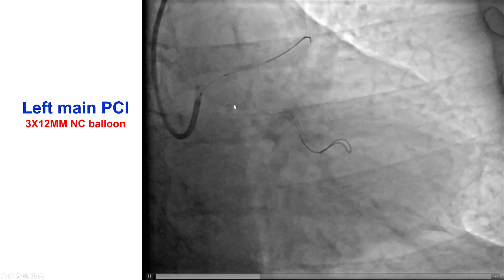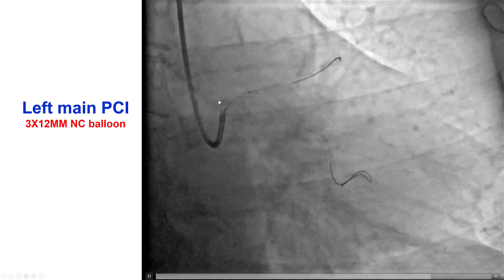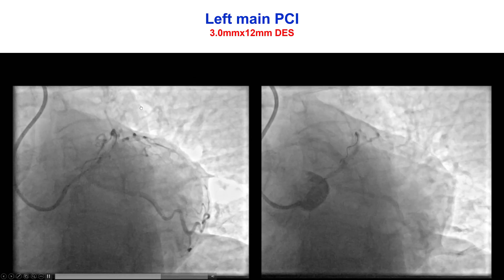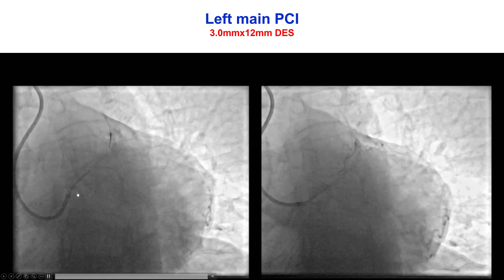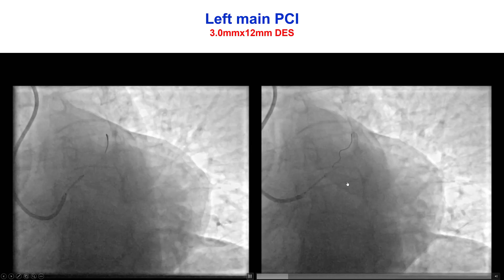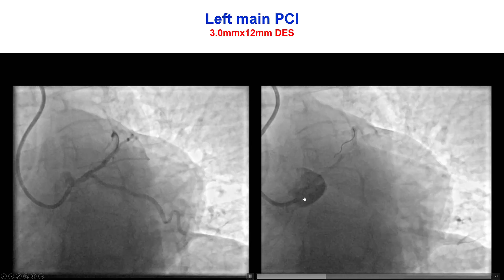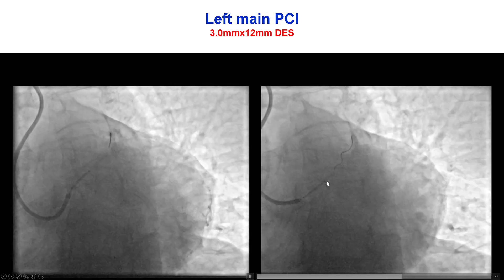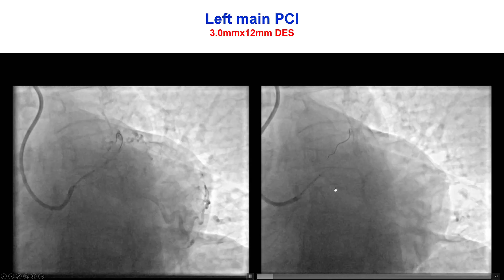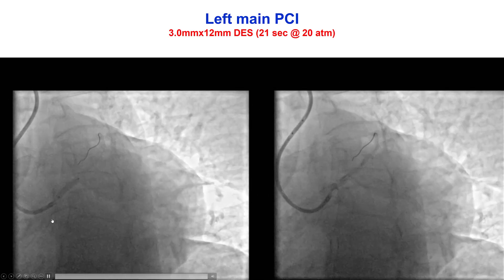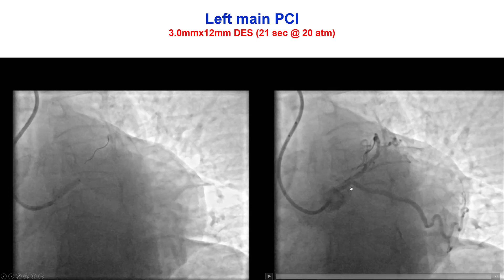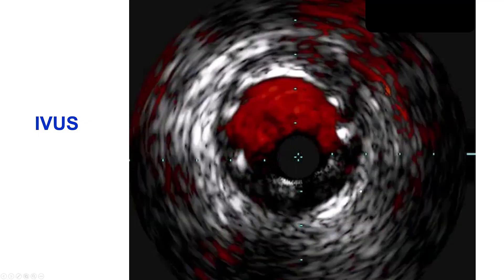Intravascular ultrasound had already shown mild calcification. A 3.0 by 12 mm stent was placed from the proximal left main all the way into the aorta. We made sure that we did not cover the distal bifurcation, and that provided a nice result with TIMI 3 flow in both the LAD and circumflex.